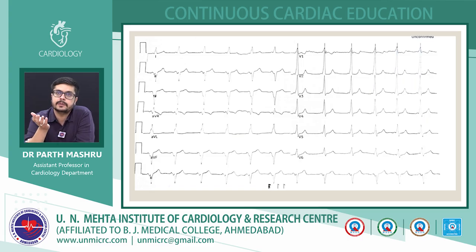because they are very difficult to remember. Even we don't remember. Being electrophysiologists, we don't remember these algorithms routinely. So if your logic is clear, you can always reach the diagnosis without applying any algorithms. So my emphasis for you would be the same: understand the concept of the delta wave and reach the diagnosis, and then apply whichever algorithm you are comfortable with, and correlate your diagnosis with that algorithm.